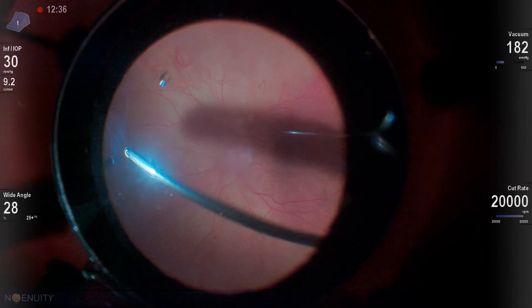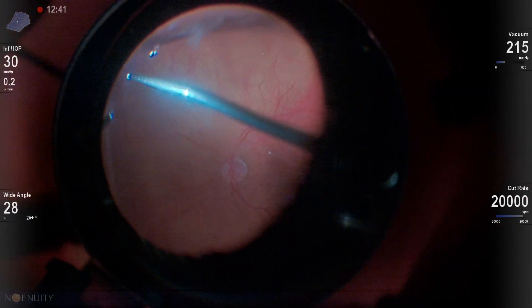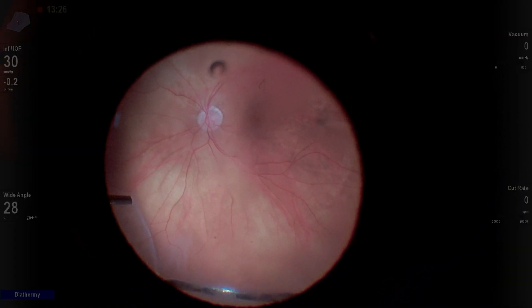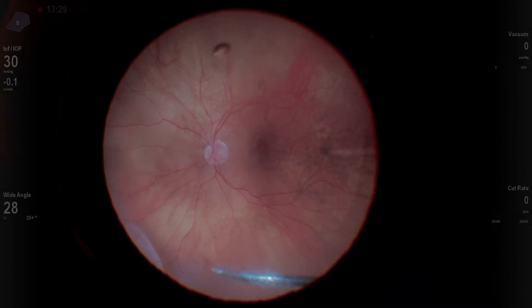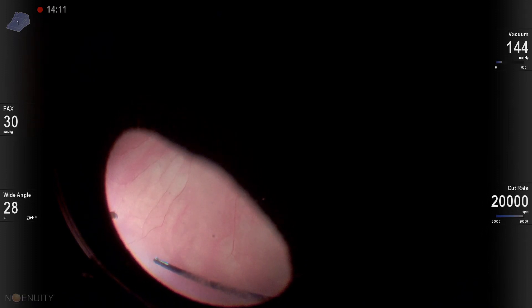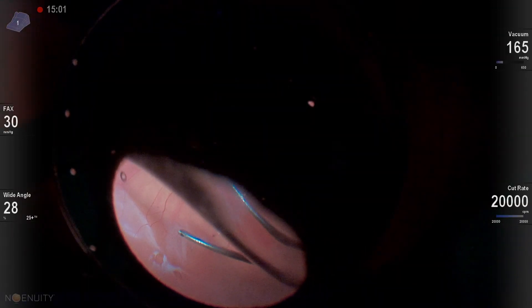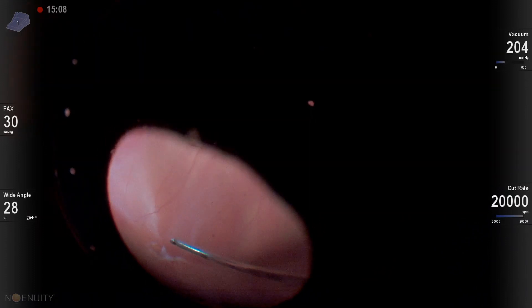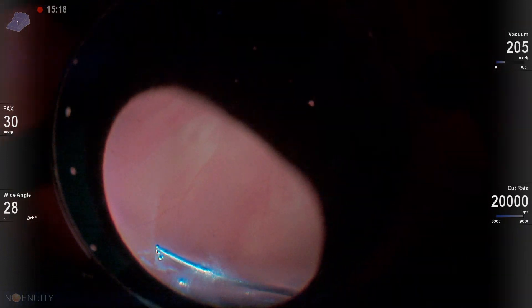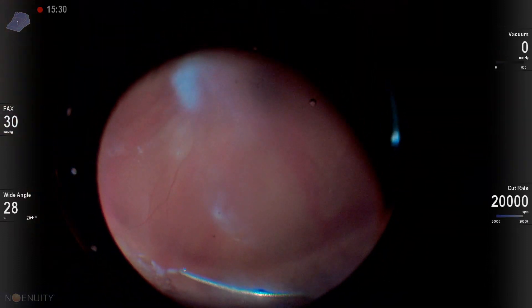Once that retina is a little more flat, we're able to cut more vigorously peripherally. I'm going to drain over this break using my cutter and put some diathermy around the break. Diathermy is critical because it takes care of any bleeding vessels, but also lets you see in case the lens goes bad during the air-fluid exchange. With a lot of vitreous still present, I prefer draining with my cutter rather than a soft tip, because any vitreous that gets incarcerated will just cut right out.